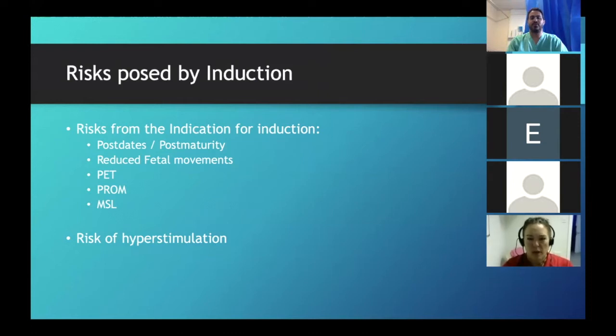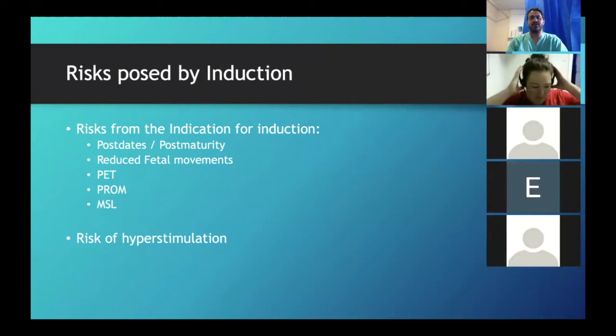If a baby is post-mature, the lower baseline? So that's the normal baseline, so that's what I would expect for normal for this baby. Okay, so most of those babies would have a lower baseline, potentially starting from 110, 120.